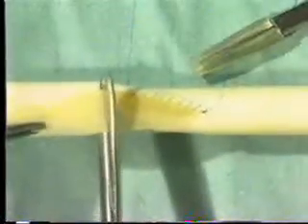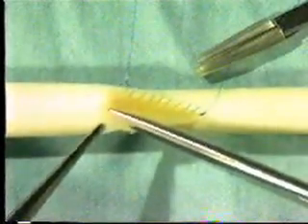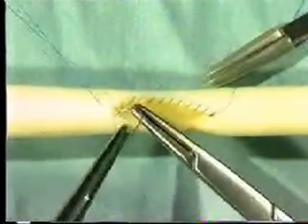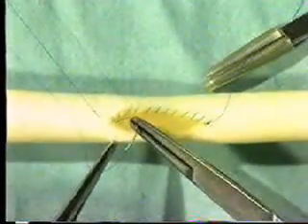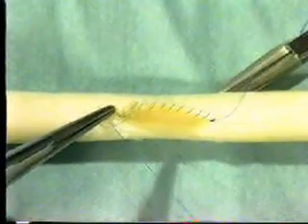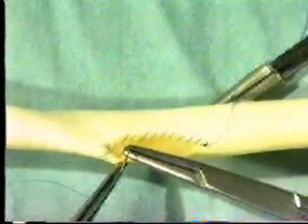Once the far end of the arteriotomy is reached, the vein graft can be cut to length and shaped appropriately. Continue to suture around the apex of the graft, taking care how you handle the vein patch now that the excess has been removed. Insert two or three sutures along the proximal wall of the arteriotomy, then place the suture in a rubber-shod hemostat.